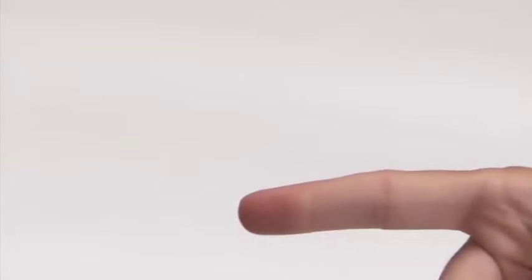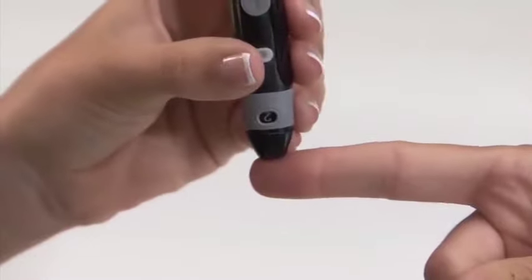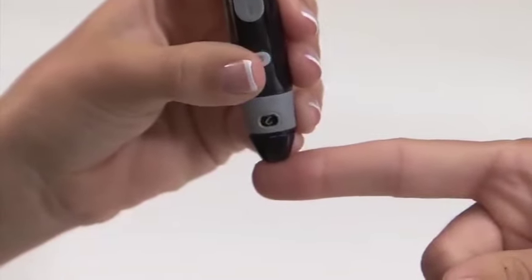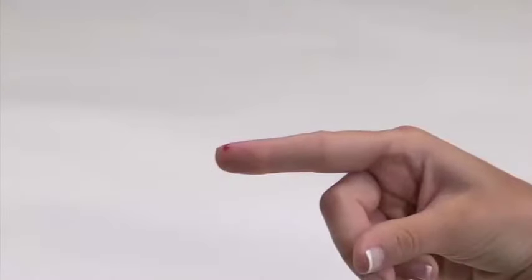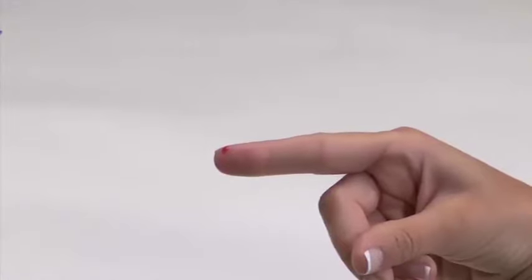Use the lancing device to obtain a blood sample. Hold the lancing device firmly against the site and press the lancing button. Lift the lancing device and be careful not to smear the blood sample.